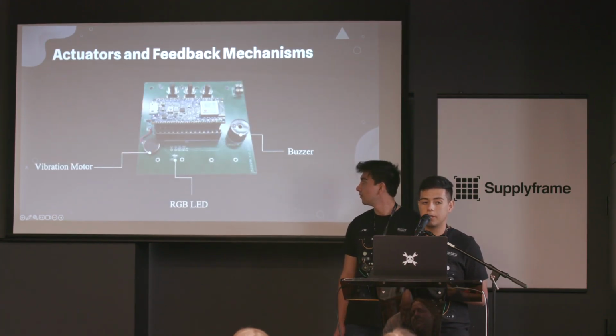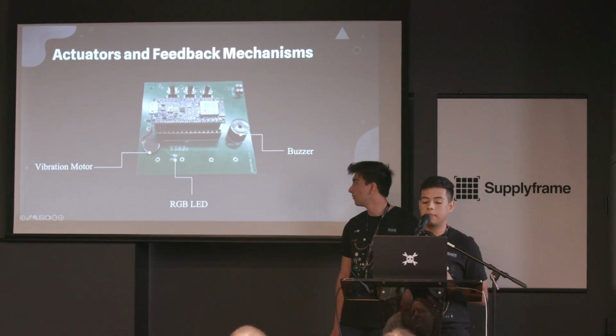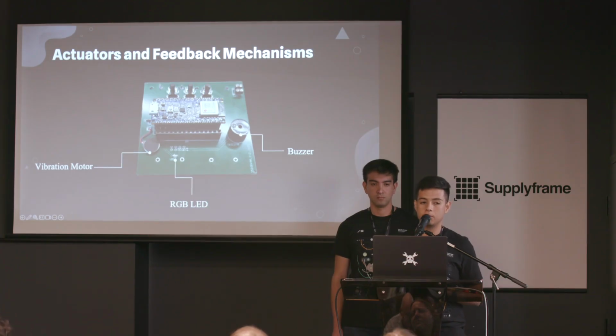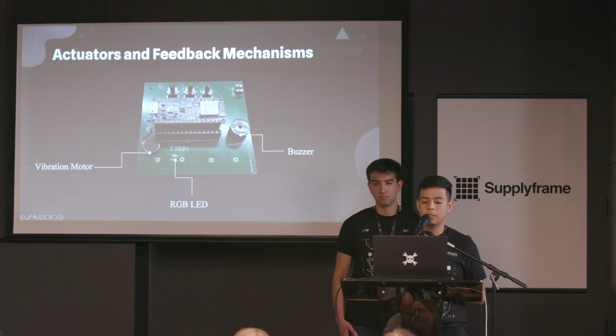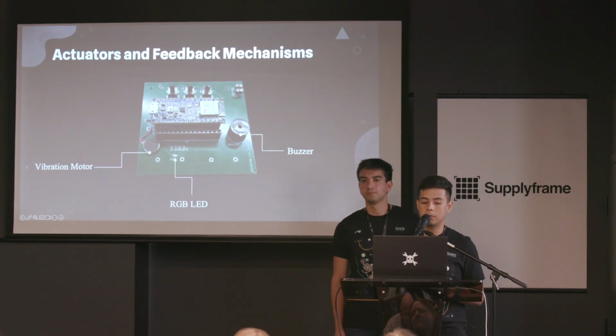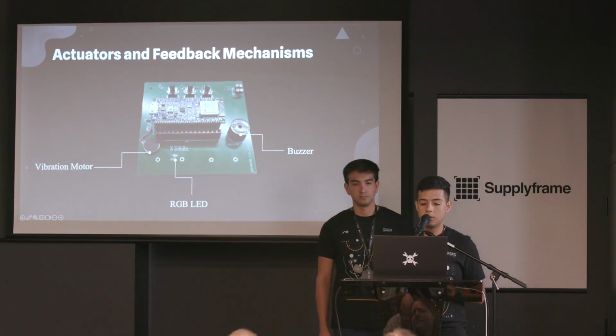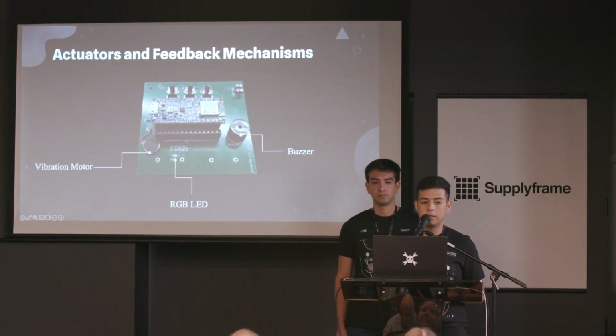Finally, we propose 3 different mechanisms to give feedback to the user. One is a haptic one that is composed of a vibration motor that will help us to transmit a haptic response when the user is doing the exercise well or is doing the exercise in a wrong way. Also, we wanted to make it simple and easy to understand for the people that are going to use it. So we include an RGB LED in order to show the status and the internal state of the machine: if it's working in the correct way, which state is working at the moment. And we also use push buttons in order to make the physical interaction easy.